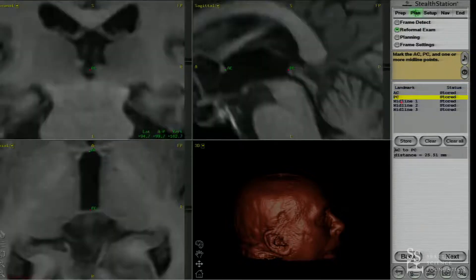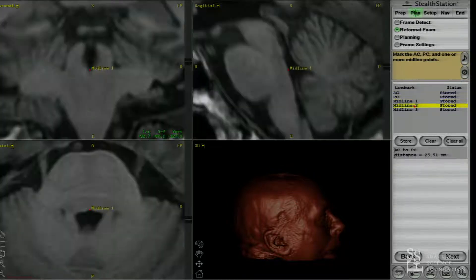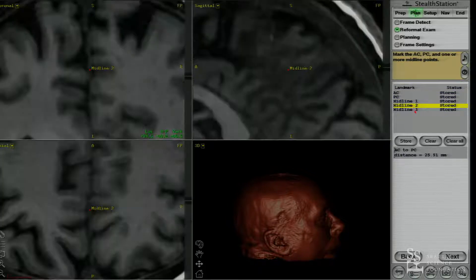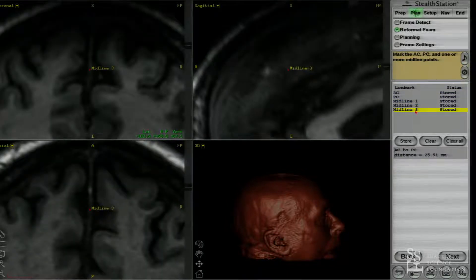Once you have the ACPC, you've kind of defined the axle, but then the head can be oriented anywhere around that. So then you pick three midline points — one, two, three — to kind of define how the head should be oriented, so the head's not cockeyed.